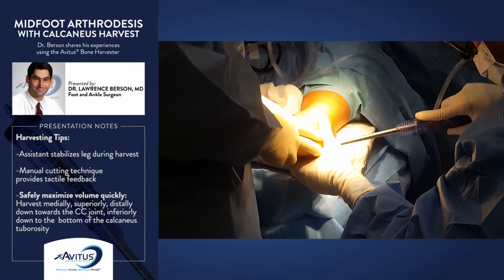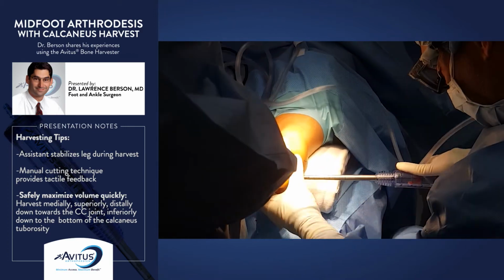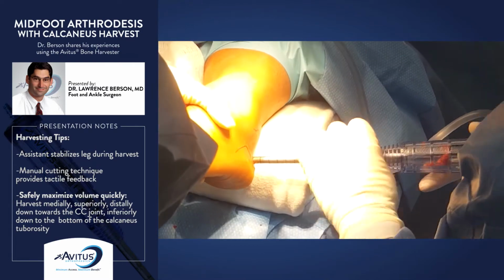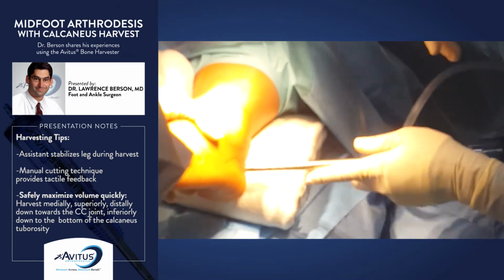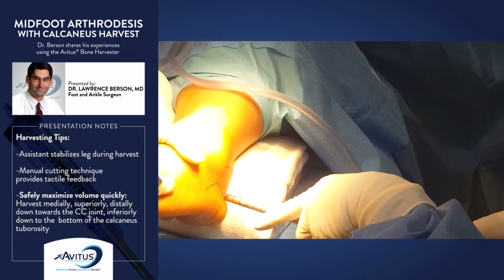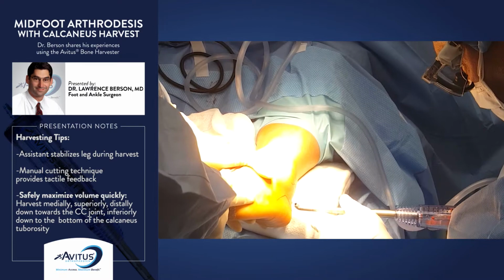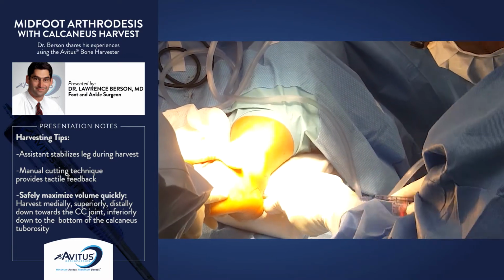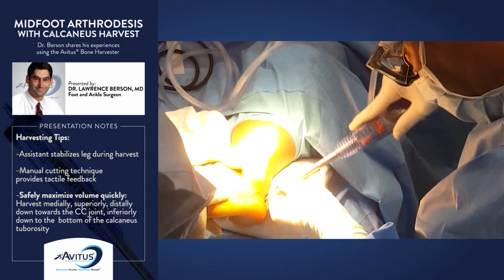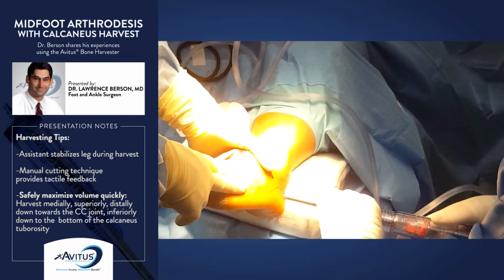Since this is all done by hand, not done by power, if you need a lot of bone, you can palpate the extent of the cortex medially, superiorly, distally, down towards the calcaneal cuboid joint, inferiorly, down to the bottom, the calcaneus tuberosity, posterior to the tuberosity. Pretty safe technique, and if you need a lot of bone, you can spend the time, which isn't a great amount of time, to gather a significant amount of bone.